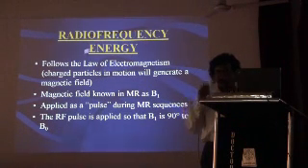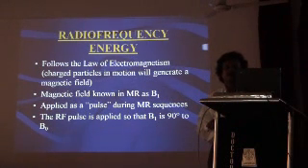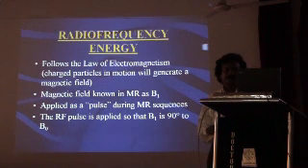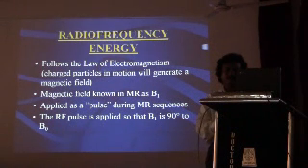What we do is that the patient is placed in a particular magnetic field. Then we introduce the radio frequency pulse, almost of the same frequency as the magnetization of that hydrogen ion. And that energy is picked up, and immediately it is released. That radio frequency energy is released as signal, and through a complicated network of computers and software, it is displayed as an image on the monitor.